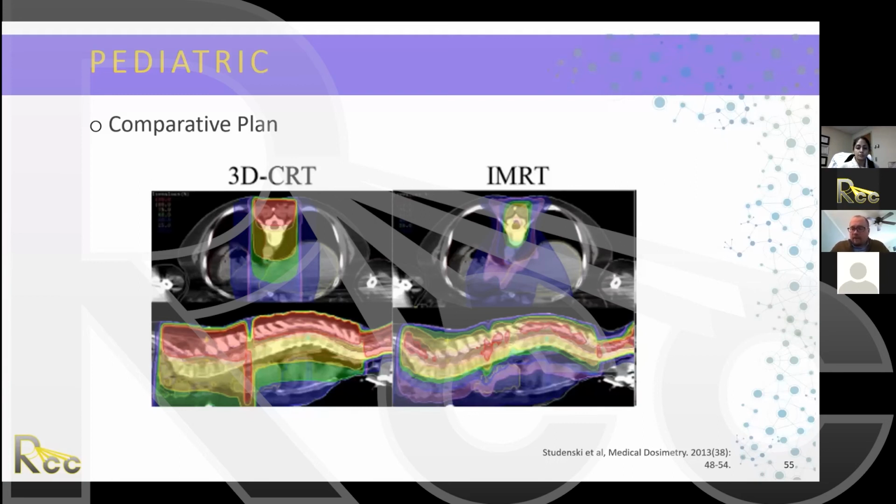Okay, thank you. For structures like the internal ear and cochlea as the OAR, similar to the lens dose, I think those are more permanent changes than cataracts. Do you have special considerations for those structures?